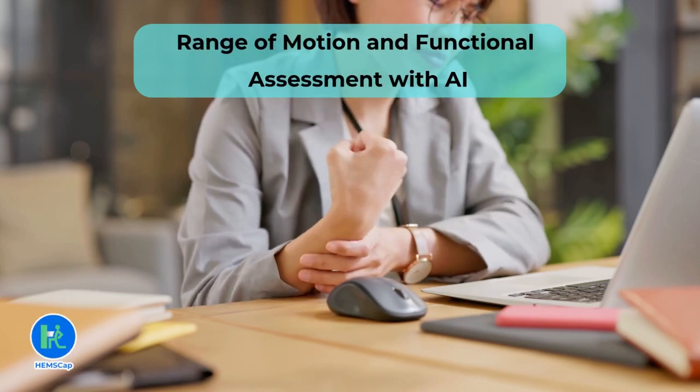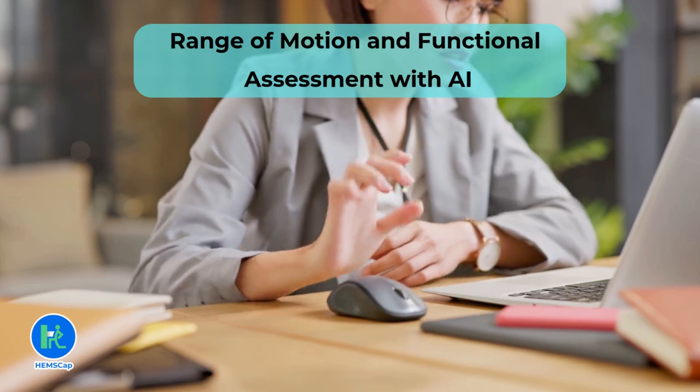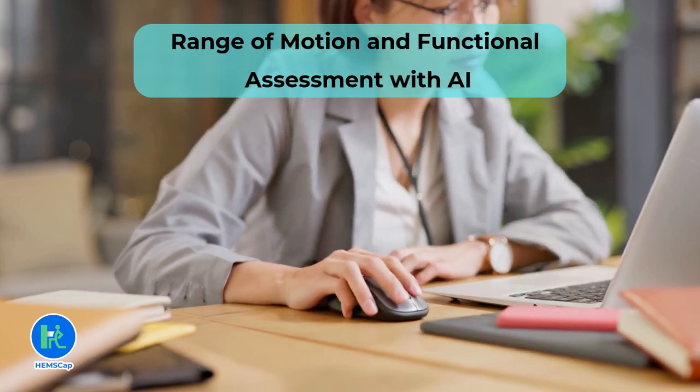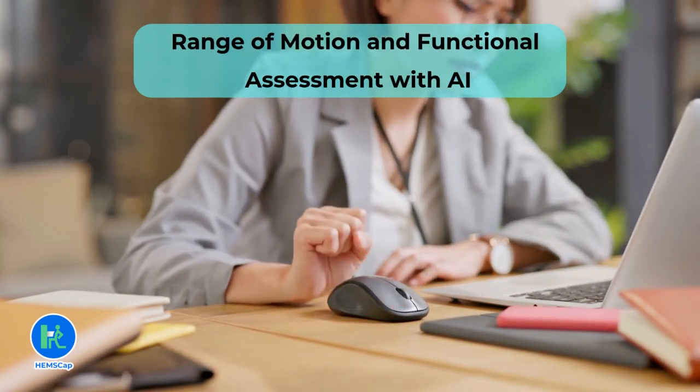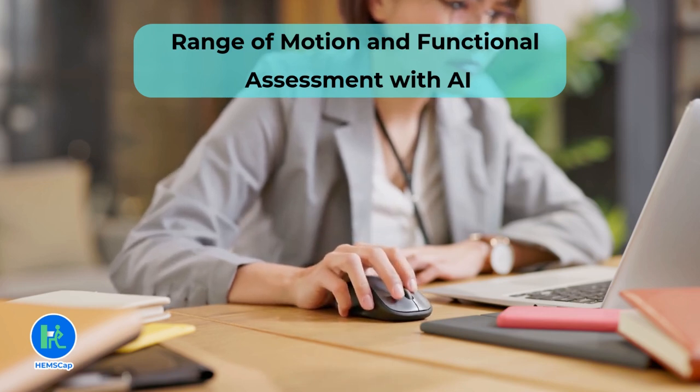Wrist range of motion (ROM) assessment includes measuring flexion, extension, radial and ulnar deviation, and rotation. These assessments are critical for identifying limitations and planning rehabilitation programs.